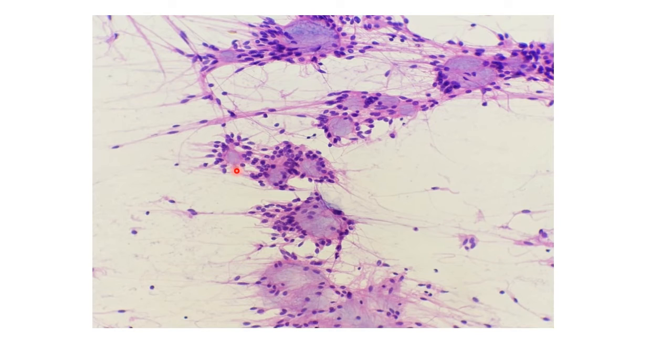Coming to the myxopapillary ependymoma, yes, you can make out the rosettes. And what do you see further? This is the myxoid stroma that you can make out here. So they have papillae, and these papillae are lined by these round to ovoid cells. And what are these? These are the fibrillary processes, giving you an indication that this is a glial tumor.